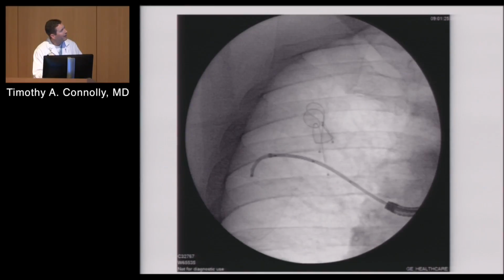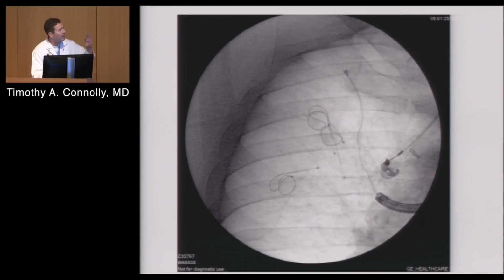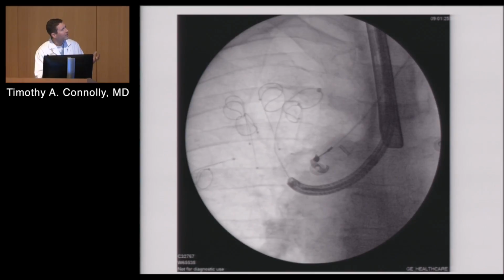So when we put them in, we're going into the random airways, wherever we can find an airway in the upper lobe or lower lobe, whichever one we've been told to do. And that's what they look like under fluoroscopy in the bronch suite. And again, the purpose of that is to reduce the overall volume of that hyperinflated lung and then reestablish recoil.